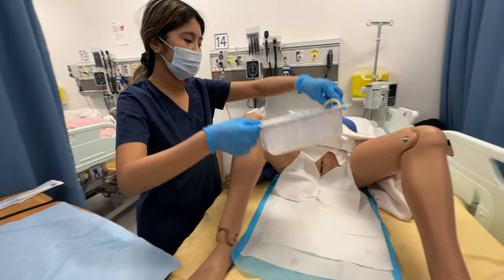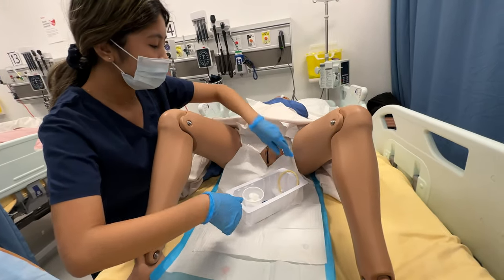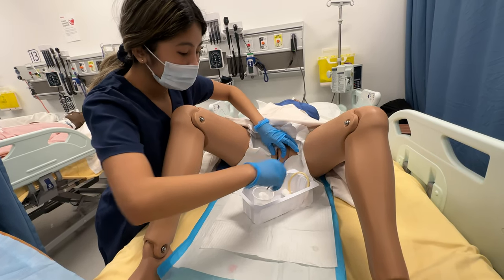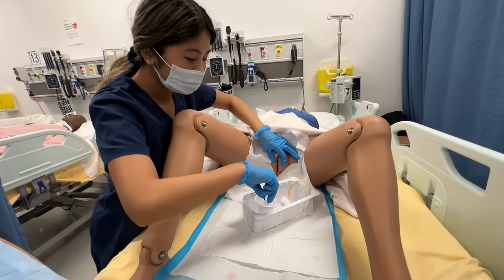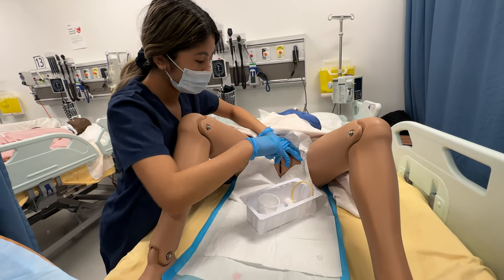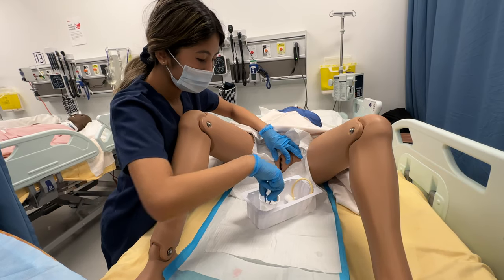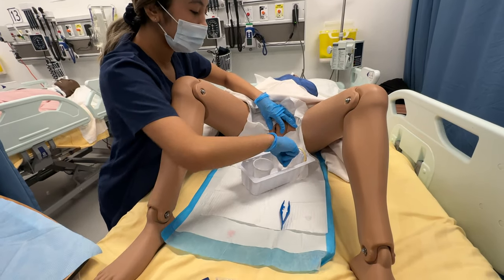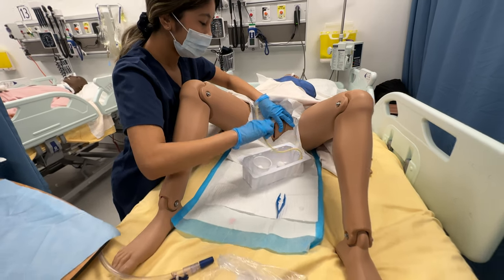I'm going to set up my sterile table and open the media. I'm going to clean the urethral area — one, two — and once that's done and clean, I'm able to insert the catheter.